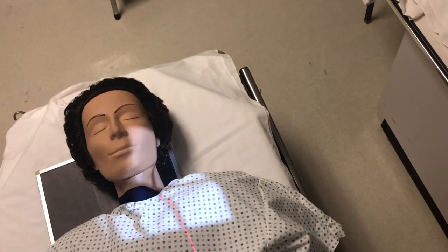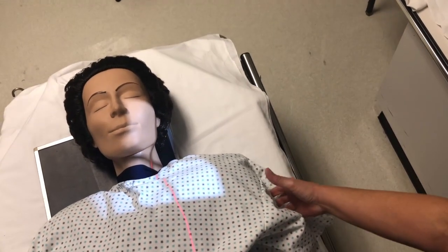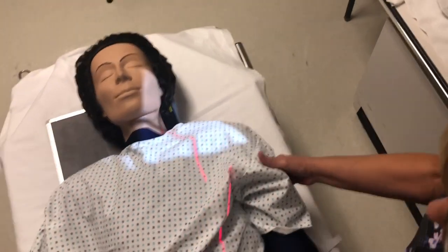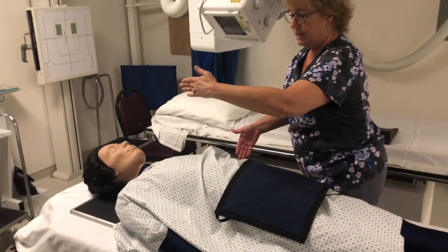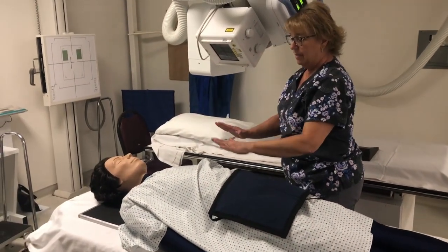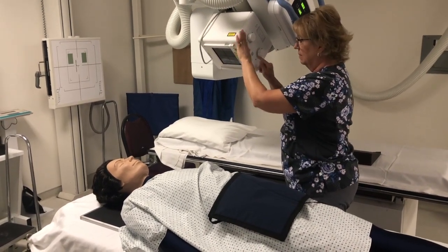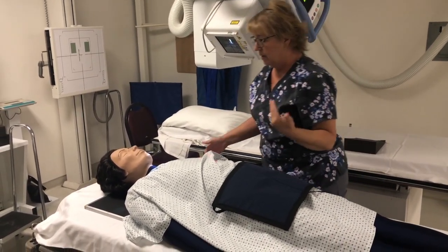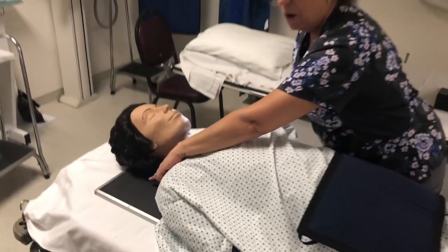This is going to be the equivalent of an LPO, because rather than having her turned LPO and me shooting straight down with a 15 cephalic angle, I'm not moving the patient and I'm putting all of that angulation utilizing my tube. So I would place my, did I just say LPO? I meant RPO.